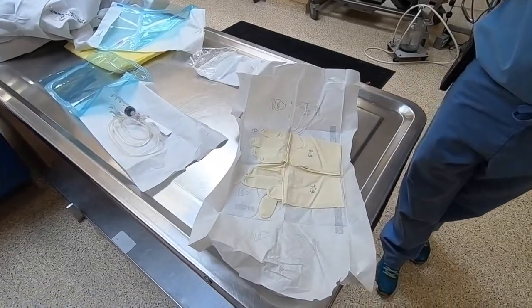So the take-home message from today is going to be: don't be afraid. It's simple and it's safe. So when you go to do a thoracocentesis, you're going to have to put together some sort of thoracocentesis set.